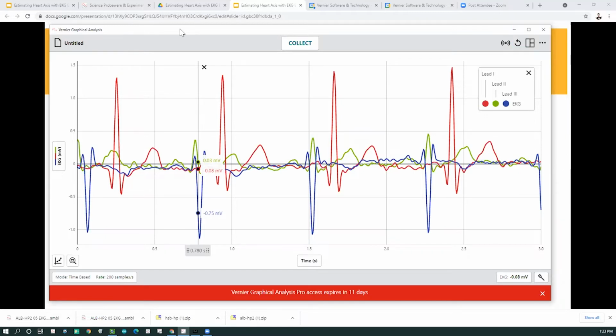Yeah, so when we did the lab to play with this prep, mine came out at the estimate being 60 degrees. What's kind of interesting is I have actually had a diagnostic EKG done since then, and of course they did, I think it was a 12 lead, so lots of data.